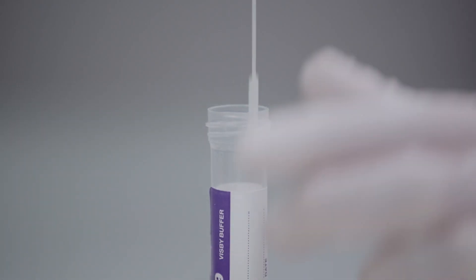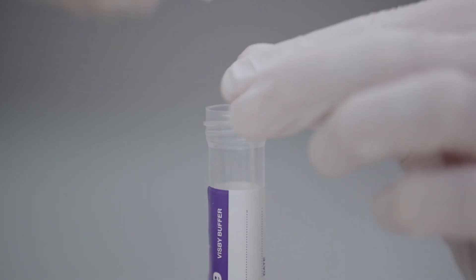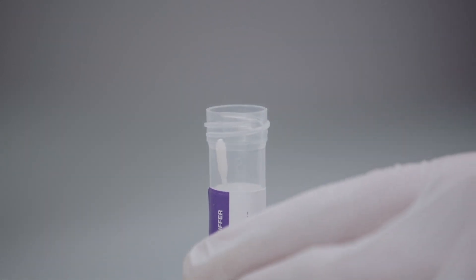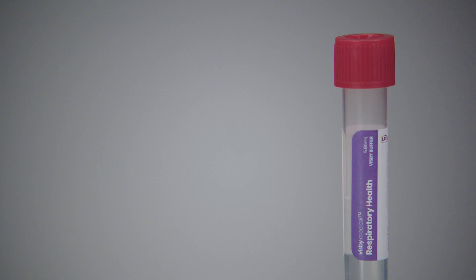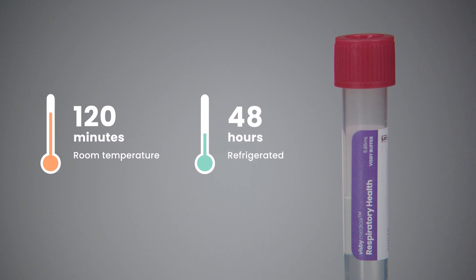Place the swab into the buffer tube and break the handle at the breakpoint before replacing the cap. The sample is stable in the respiratory health buffer up to 120 minutes at room temperature or up to 48 hours if refrigerated.